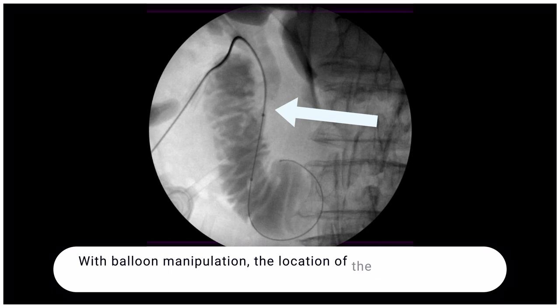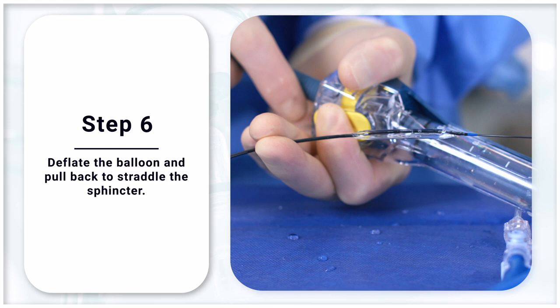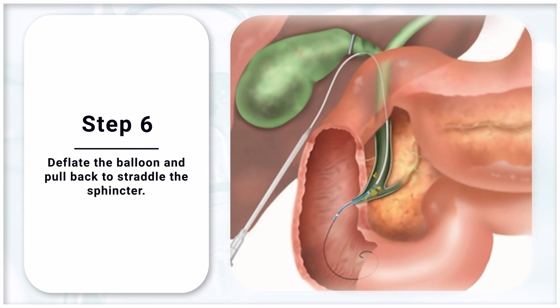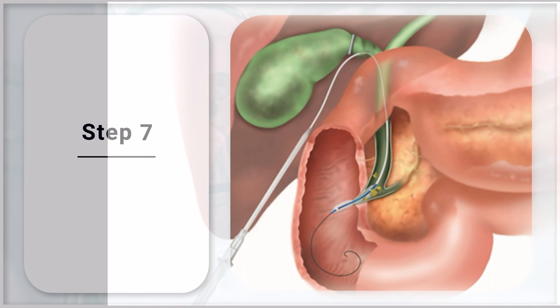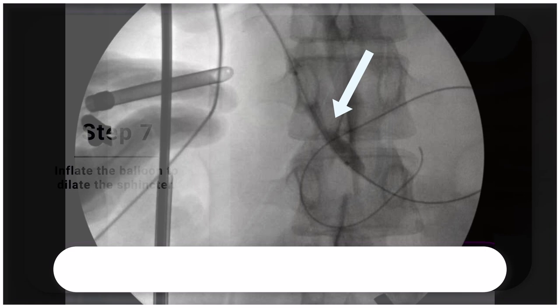Step 6: Deflate the balloon and pull back to straddle the sphincter, ensuring that the sphincter is halfway between the marks on the balloon. Step 7: Inflate the balloon to dilate the sphincter. A waist should be seen to indicate correct placement of the balloon.